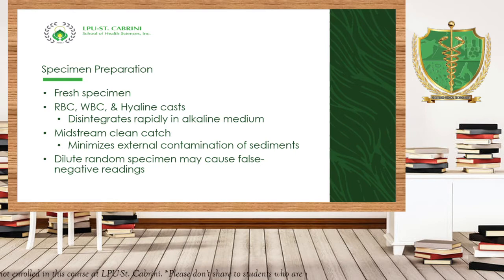But let's take, for example, glucose. If you have the presence of glucose, the glucose will decrease because of the utilization of the microorganisms. The odor of the urine will be affected, the pH will be affected, and so on and so forth. That's why it is recommended to test the urine immediately after the collection, or fresh urine.